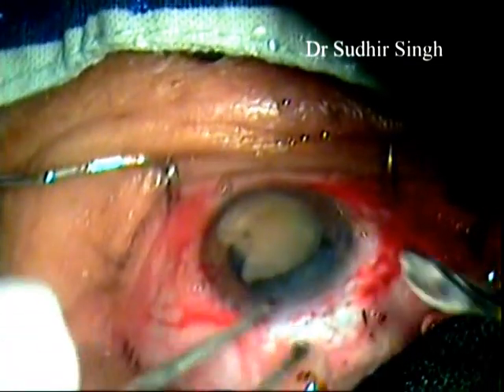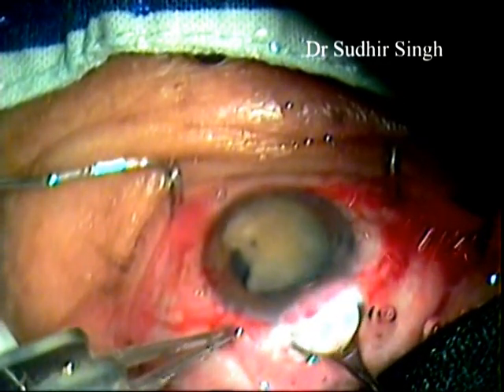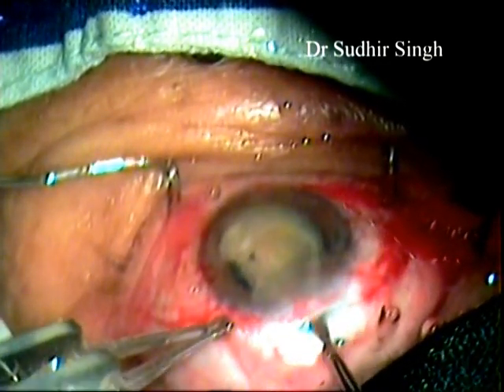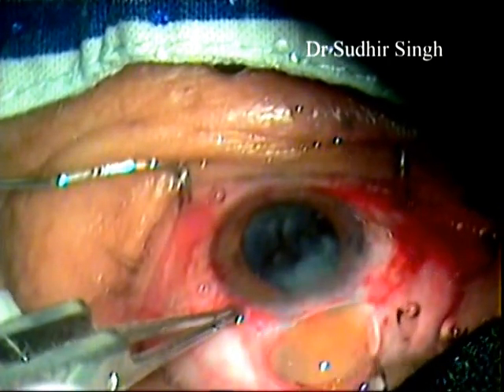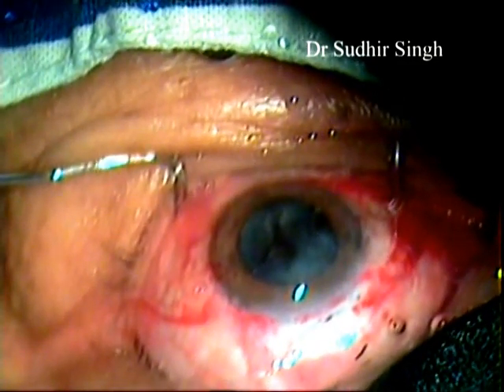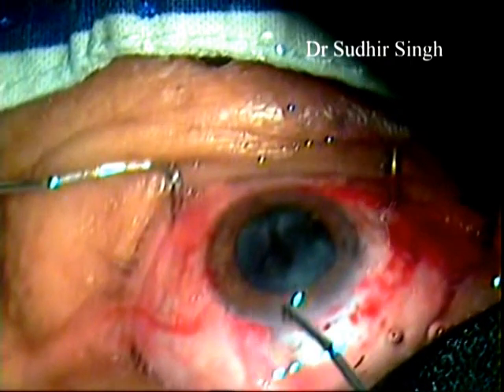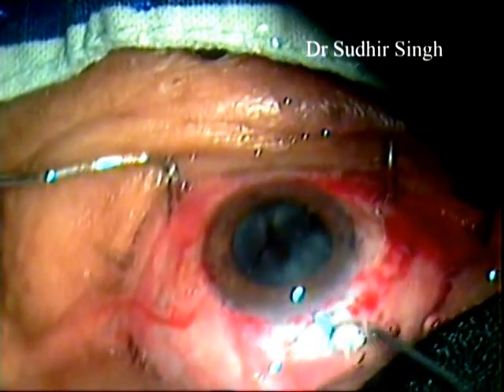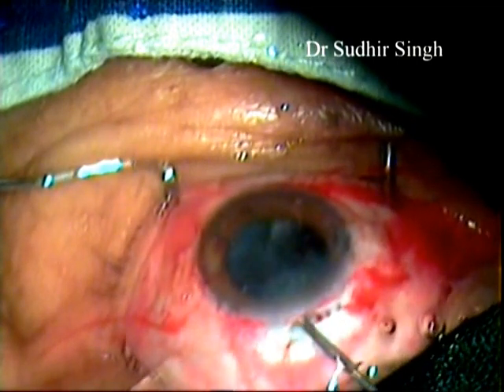Again, viscoelastic is placed between the cornea and the superior surface of the remaining nucleus, and between the nucleus and iris. The lens loop is introduced through the tunnel and positioned between the iris and the remaining part of the nucleus. The remaining part of the nucleus is engaged in the lens loop and slowly withdrawn from the anterior chamber along with the nucleus fragment, while the posterior lip of the tunnel remains depressed.